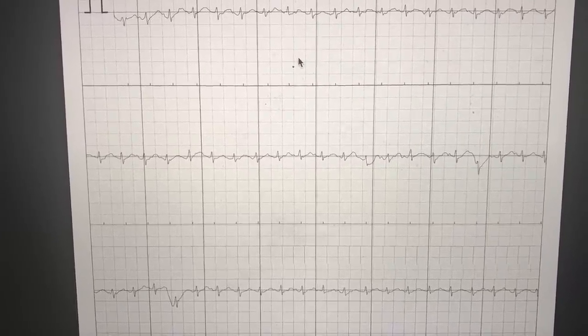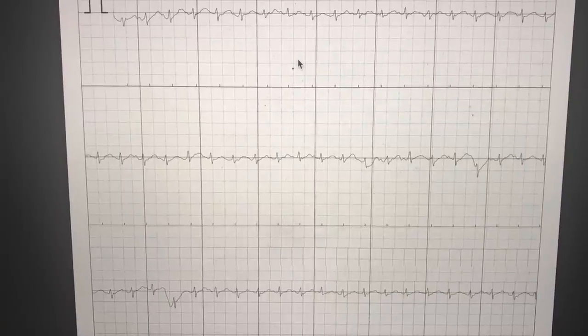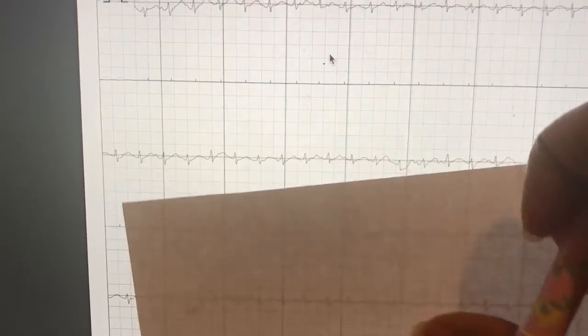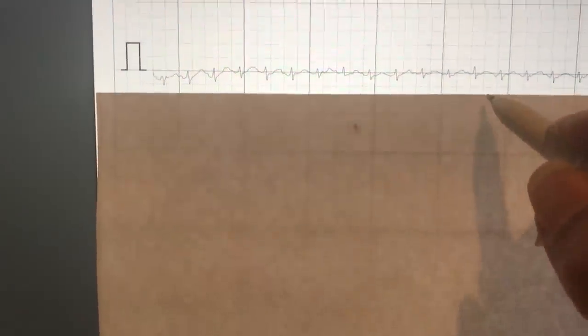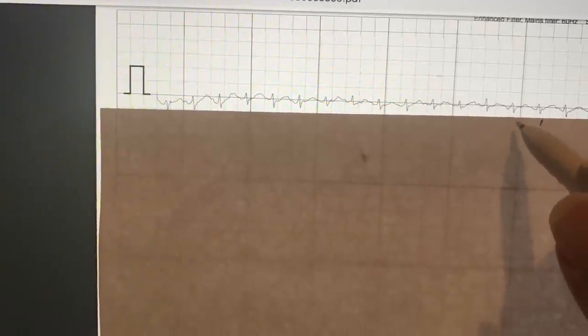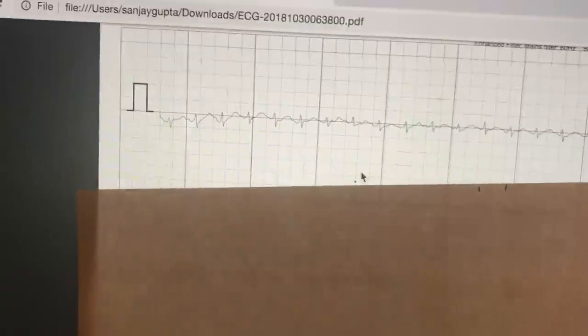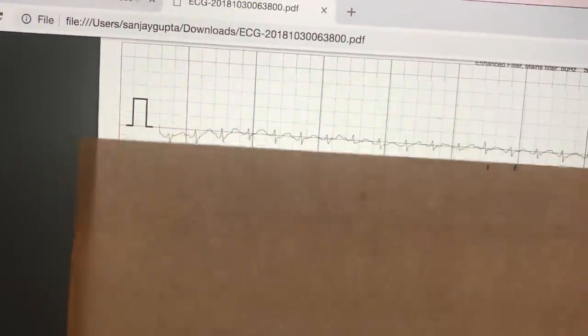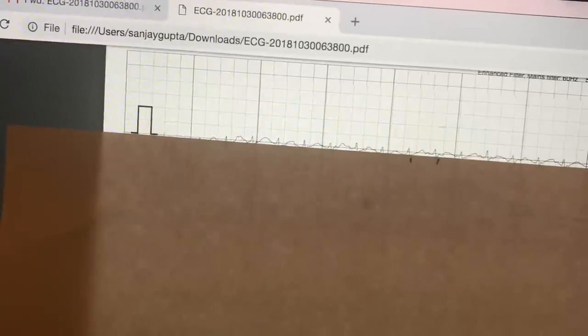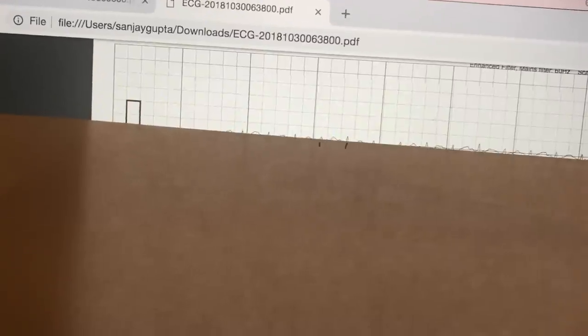The second thing is: is it regular or irregular? Remember, AF is irregular. When you look at this tracing, it looks all over the place. But what you should do is take a piece of paper and mark with a line where one spike is, then mark where the next spike is. If you move it along and the marks fall consistently on the spikes, it is completely regular. So even though this looks fast, it is not atrial fibrillation, because atrial fibrillation is irregularly irregular — the two marks will not fall on the spikes as you move along. Since they do, you can be confident this is not atrial fibrillation.